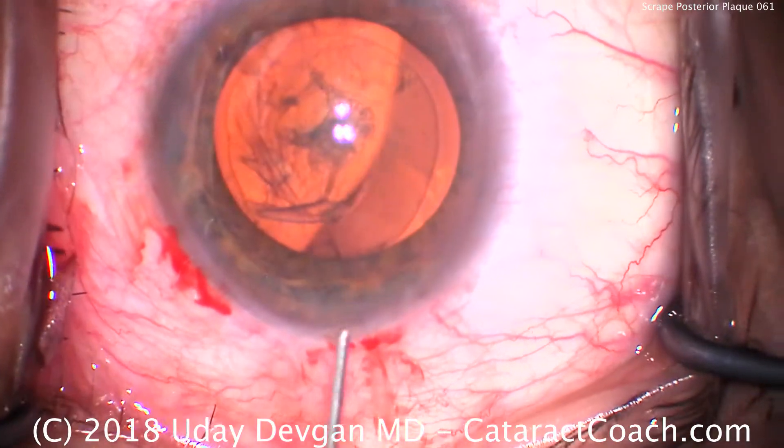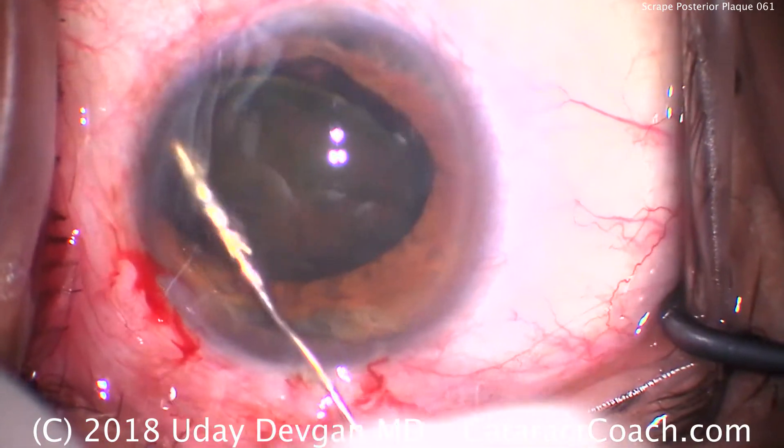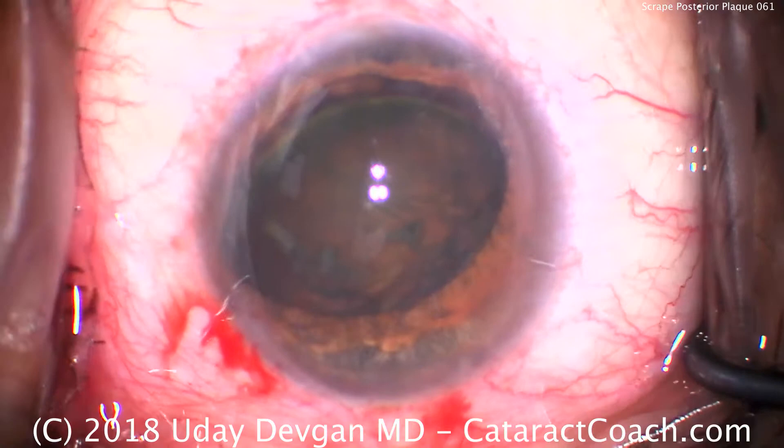Balance salt solution on a blunt cannula for our hydrodissection. We're going to do a few fluid waves. Notice how we tilt the nucleus up out of the capsule bag, and also how we re-inflate the eye with viscoelastic.